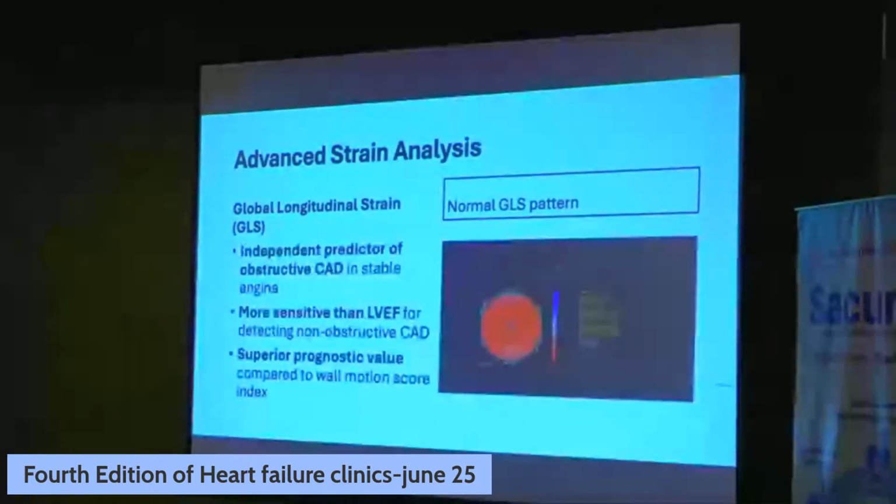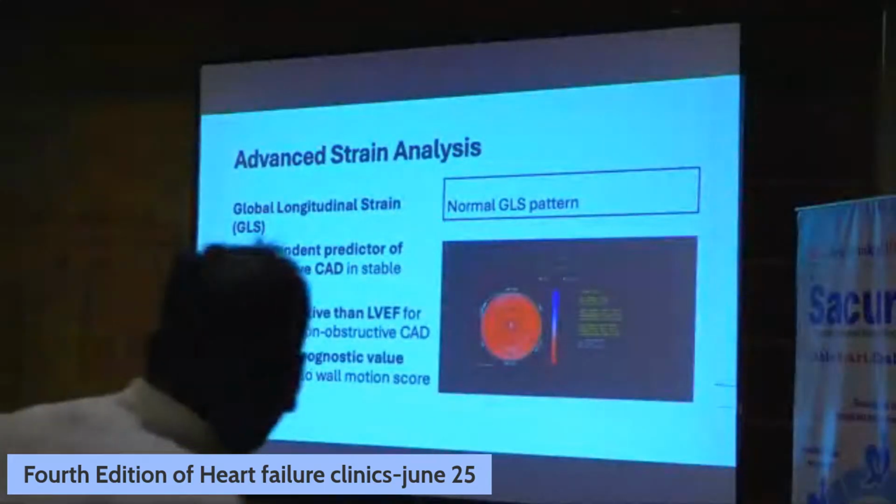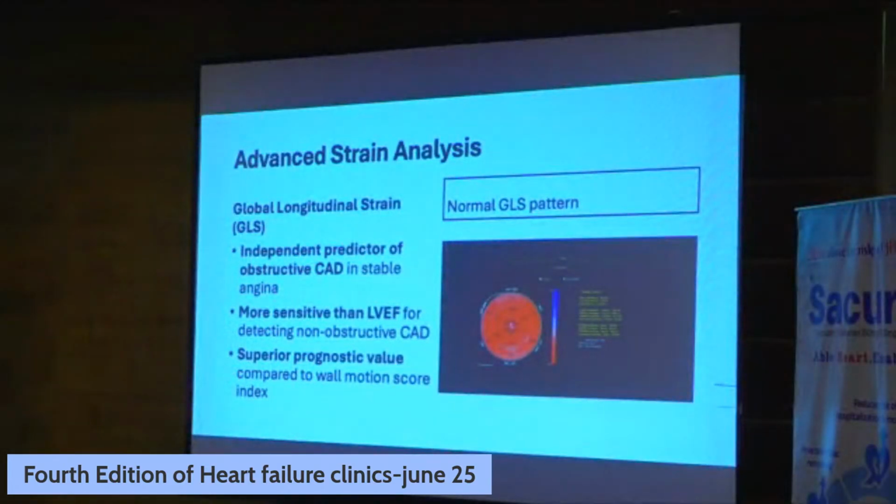Valvular heart disease. Normally, by the time ventricular dysfunction sets in, let us say a person comes to us with an ejection fraction of 45%, where the normal ejection fraction is 53% or 54% based upon the gender. But if the ejection fraction is 45%, then what is happening? By the time the EF reduces from 53 to 45, the GLS falls from 17 to almost 11.